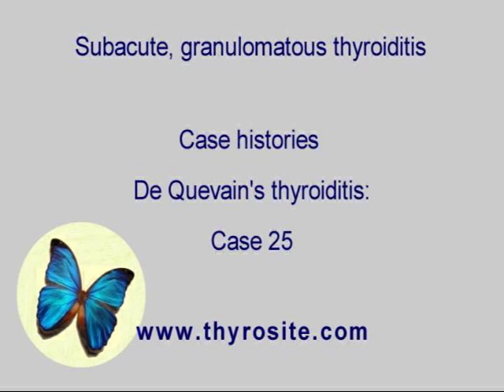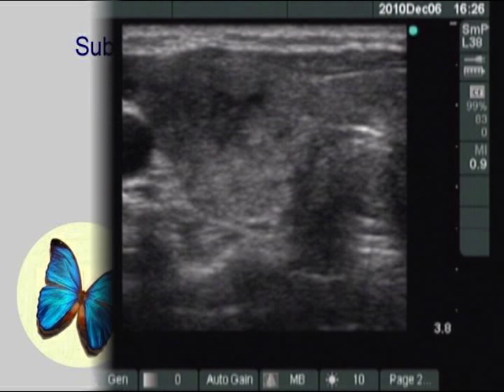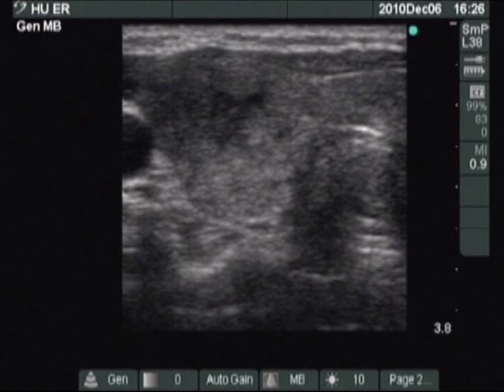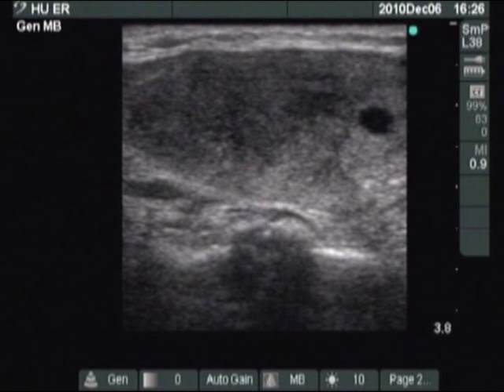A patient is demonstrated with typical complaints implying thyroiditis. There are hypoechoic lesions with blurred borders in the right lobe.